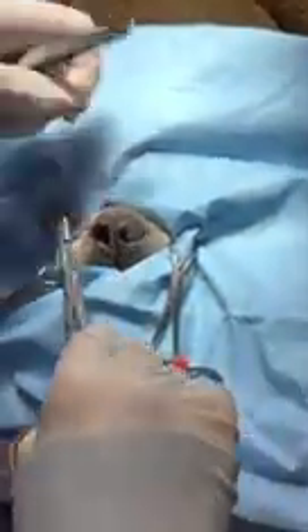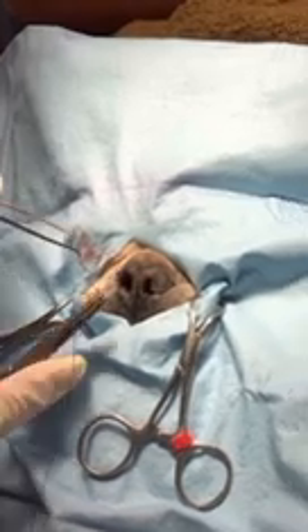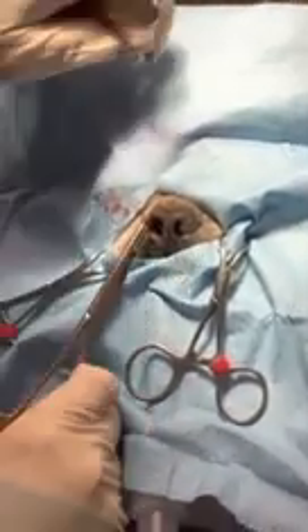Usually it takes two or three sutures to complete that. It's really a straightforward procedure — the dogs don't experience a lot of pain or anything associated with this procedure, and it becomes instantly beneficial. In fact, they sometimes wake up from anesthesia much nicer because they're breathing easier. I'll just put this last one in and then do the other side to match, and then we'll wake her up.